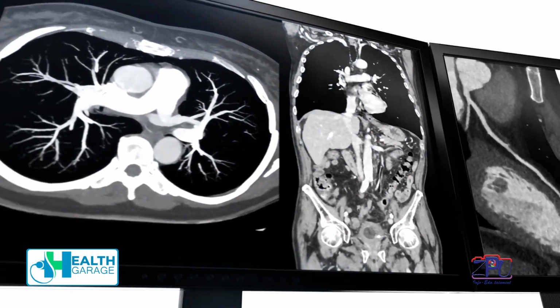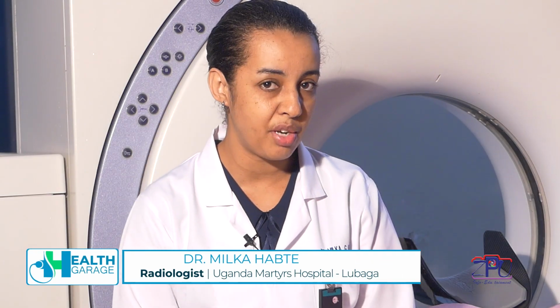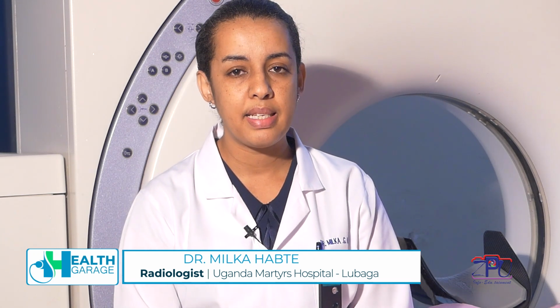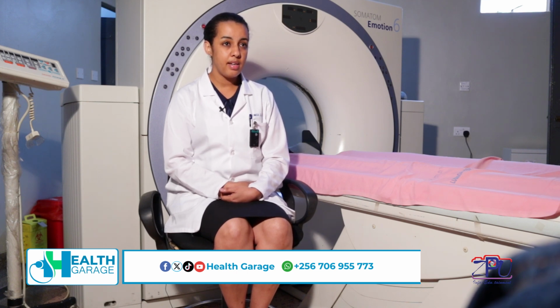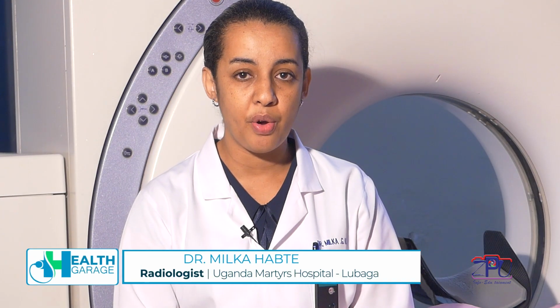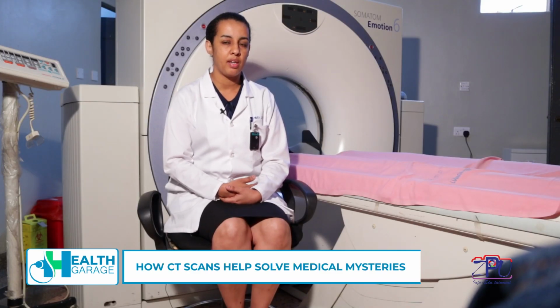If we look at the conventional X-ray, the typical X-ray examination we do in a hospital, it's very useful, but with some limitations. It may not give us the detailed information we are looking for. Whereas a CT scan uses X-ray, yes, but it doesn't use one beam as in the conventional X-ray. The X-rays come in a circle, and they're imposed on different body parts and give us detailed information of the body part in slices. The thinner the slices are, the more information and the more detail we get from the images.